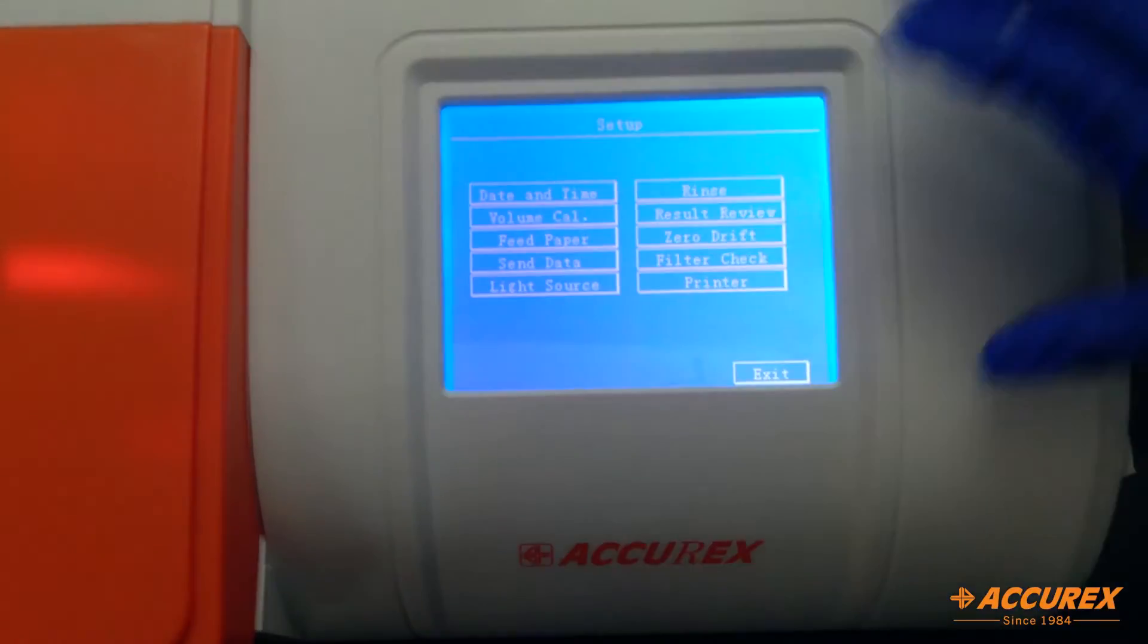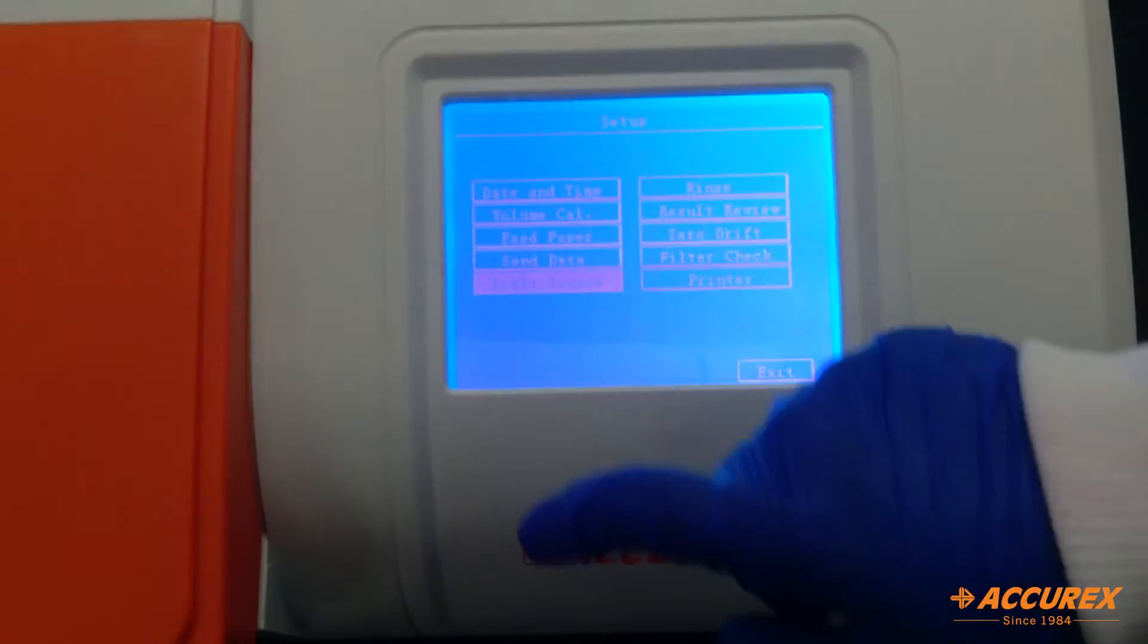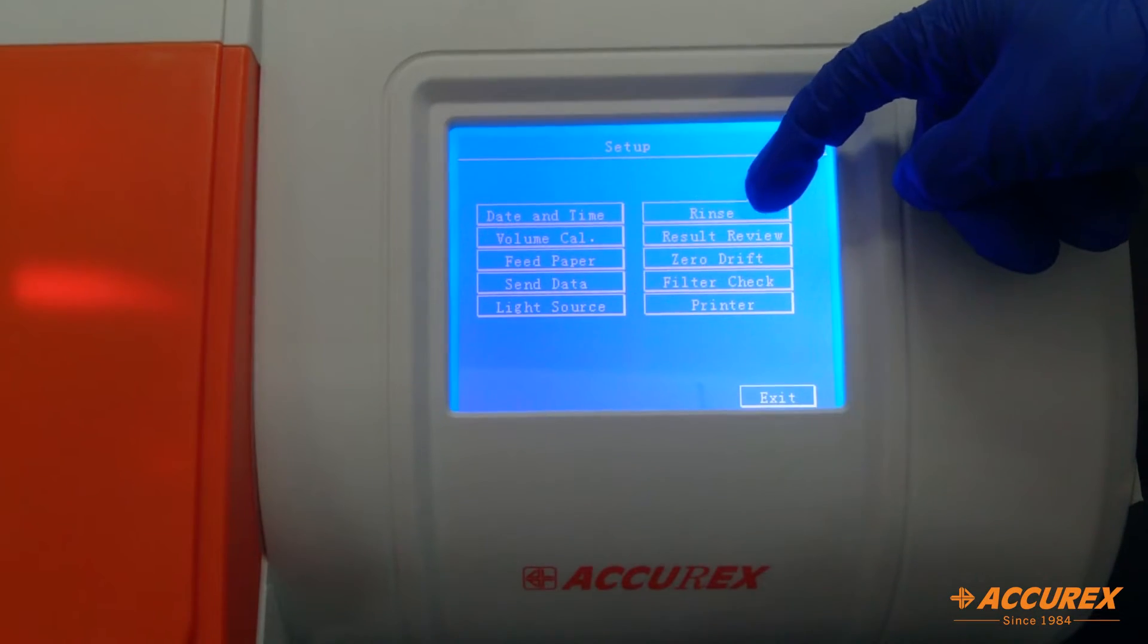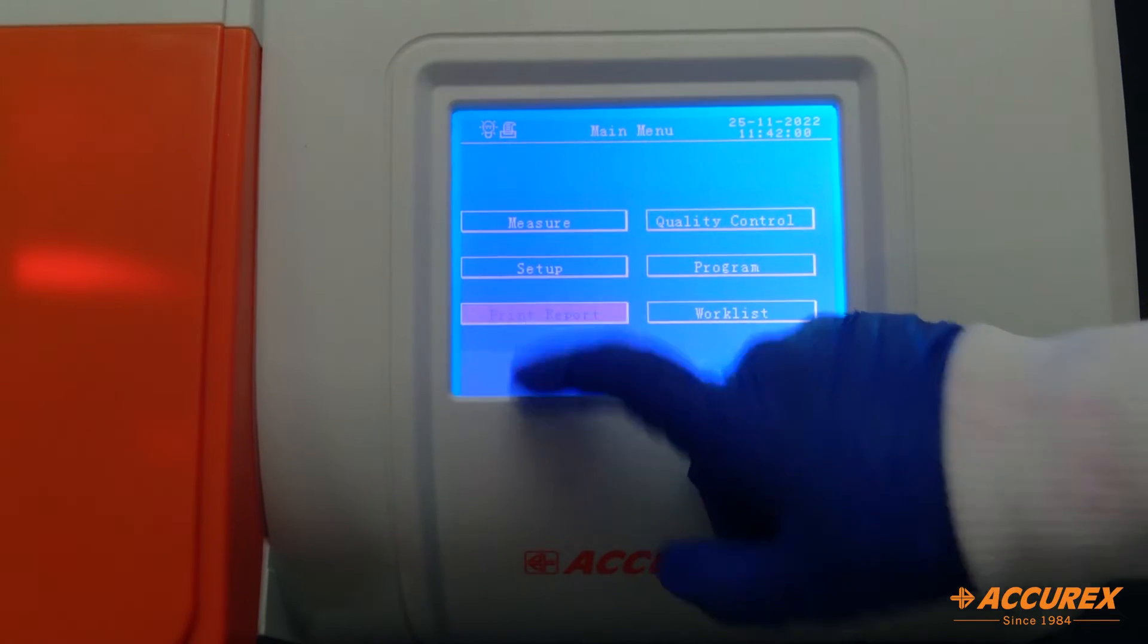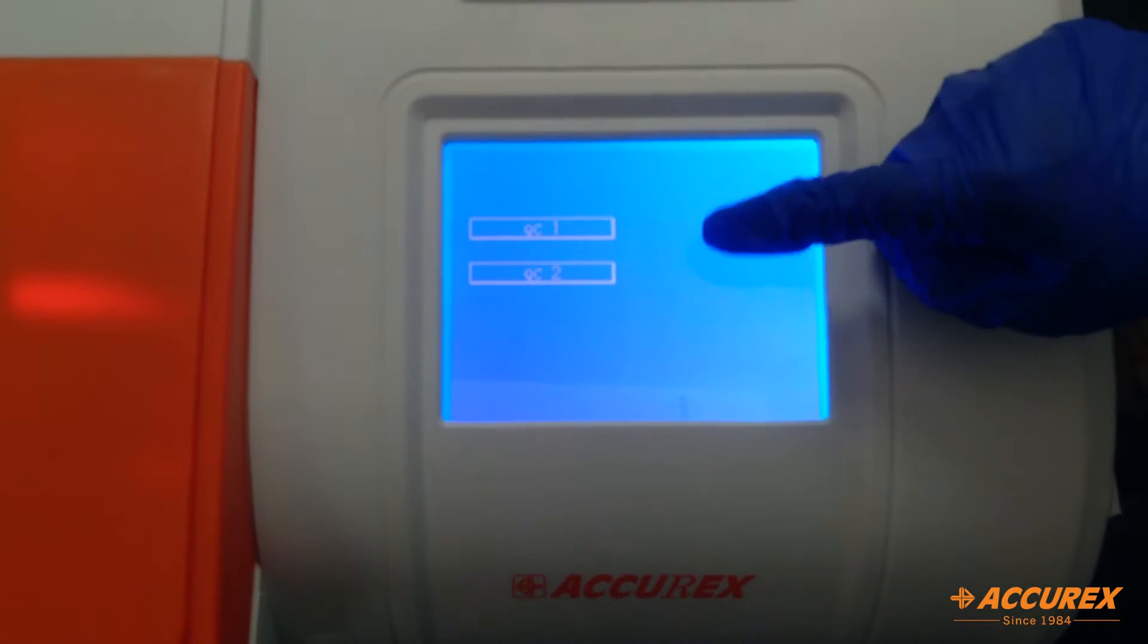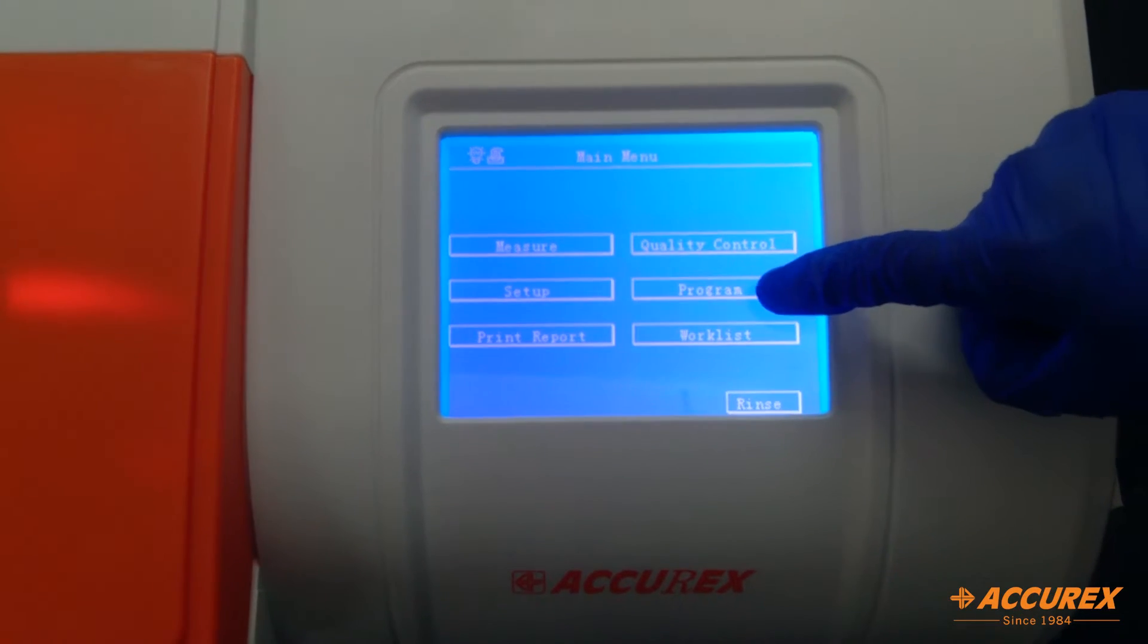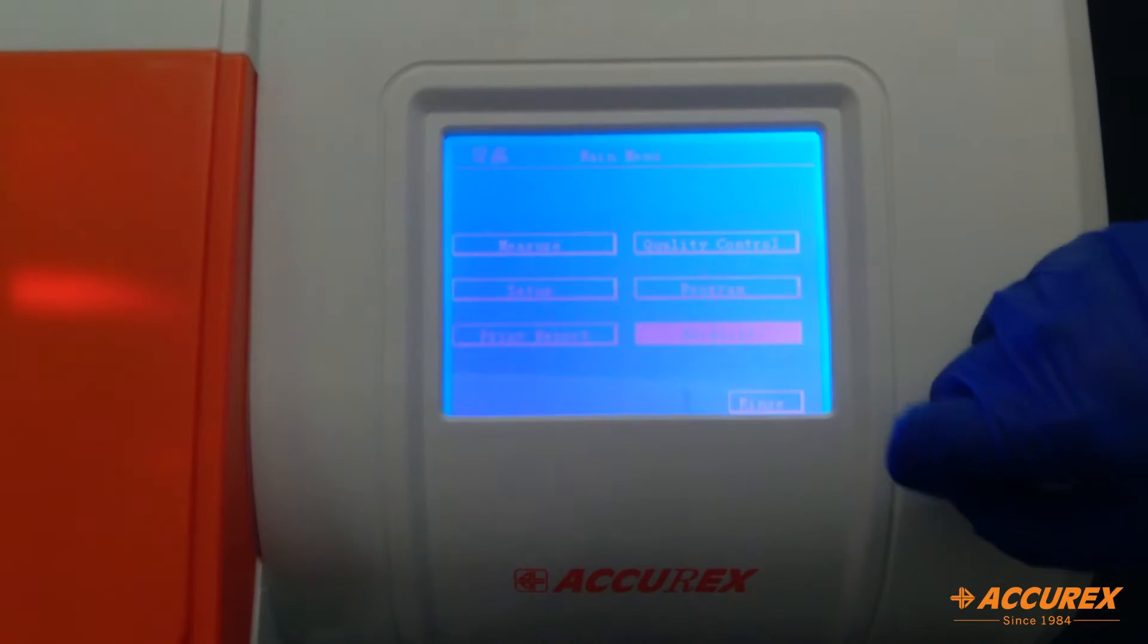Data send, light source. If the analyzer is not in use, you can just turn off the light source, and when you need it, you can turn it on again. Here there is an option for rinse, result review, zero drift, filter check, and printer. Third is the print report from where you will get the print. If you want to run any controls, there are the options QC1 and QC2. If you want to edit or create any new test, you can edit from here. The last one is the work list.